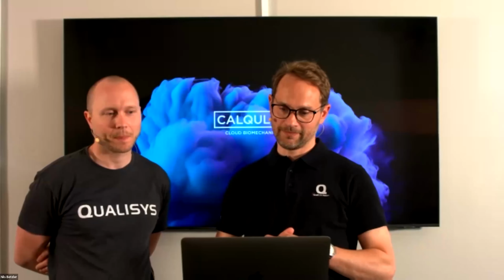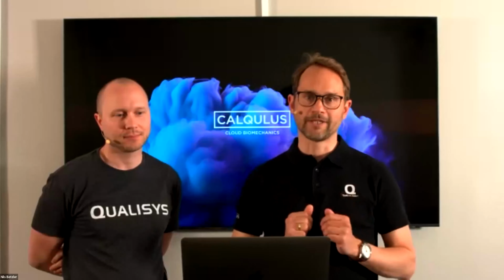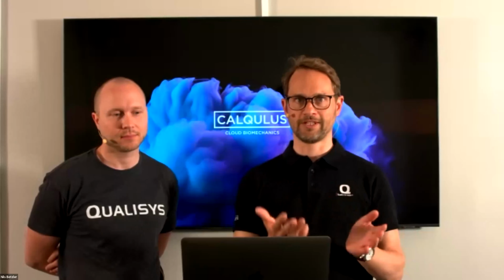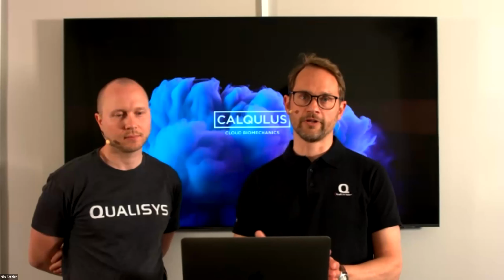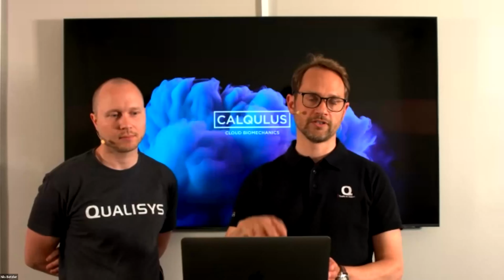Another question, can I create my own pipeline? Yeah, very good question. In theory, you can take our pipeline and make a lot of modifications so it becomes your own pipeline. But the one thing that is limited as of now is the report layout. So the report layouts are predefined. So the running report has certain charts.